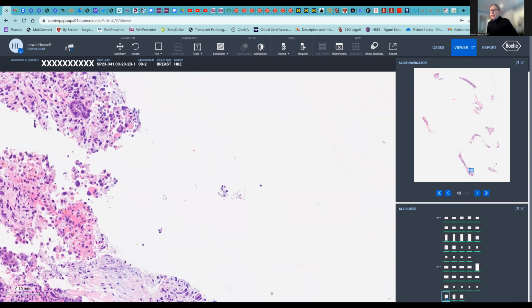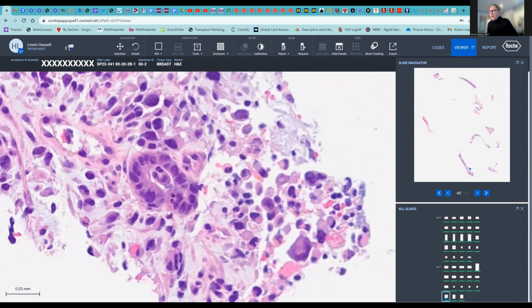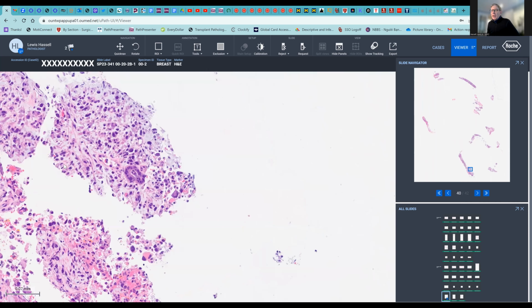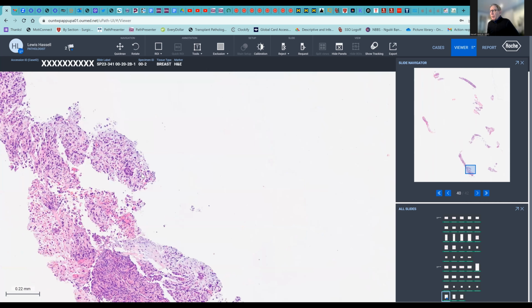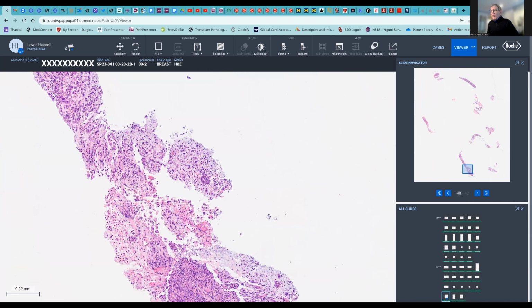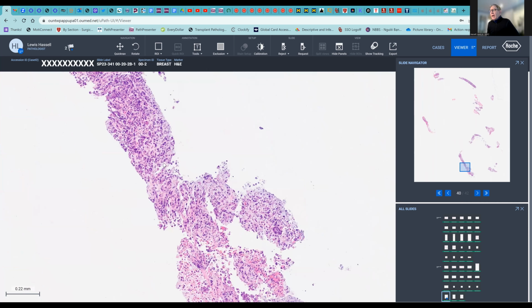And with careful search, there were a few areas such as this gland here, which I think looks to me to be probably a malignant gland. The nuclear features are very similar to the surrounding cells. So we have sort of a sarcomatoid differentiation or a very high-grade appearance, but a component of adenocarcinoma here. So in many organs, this might be classified as a carcinosarcoma.